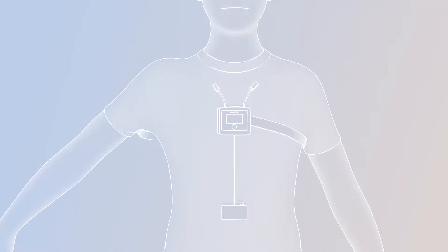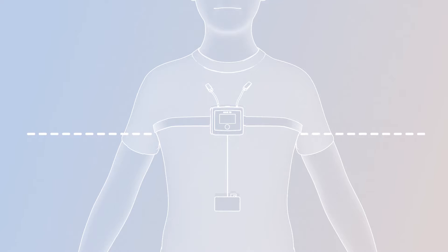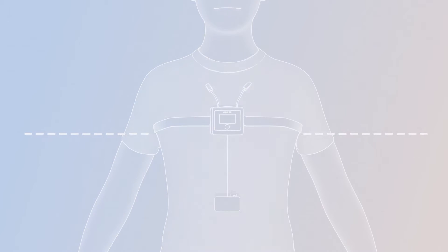Take the two belts out of the carry case. Take one belt and snap it to one of the connectors on the back of the T3 device. Then arrange the belt around your back, make sure the belt is not twisted, and snap the other end to the connector on the back of the Knox T3 device. Once in place, position the belt just below your armpits. The bands are fitted with loops so you can adjust the length if needed.